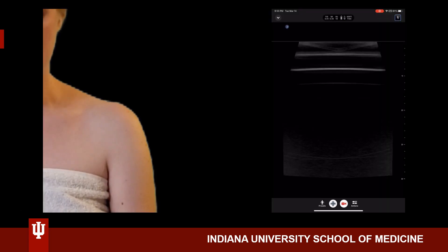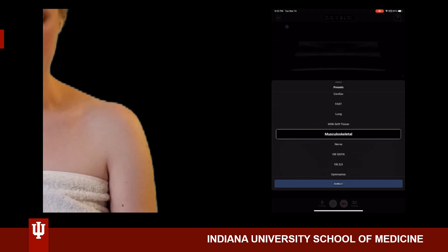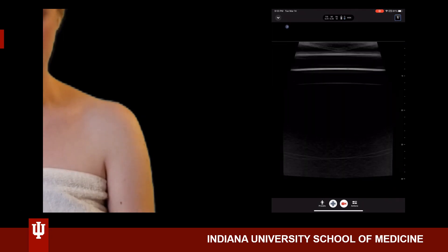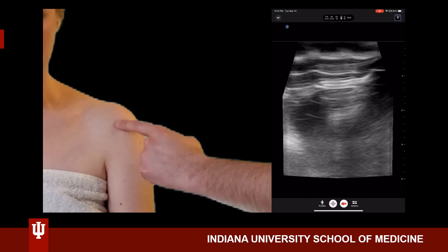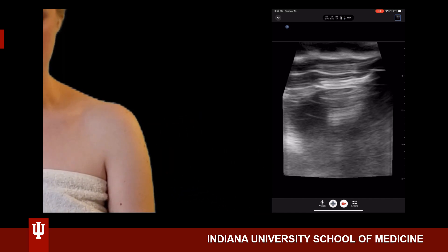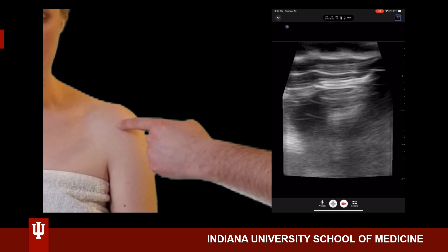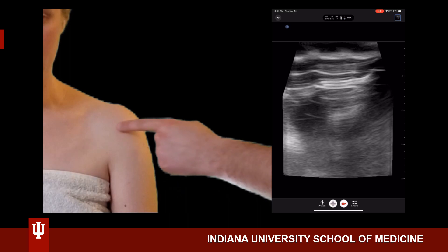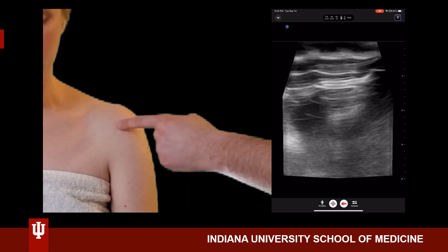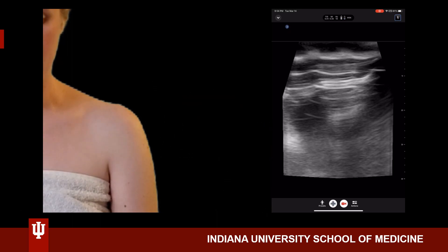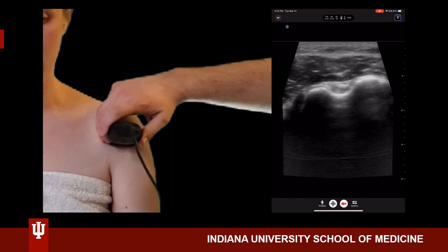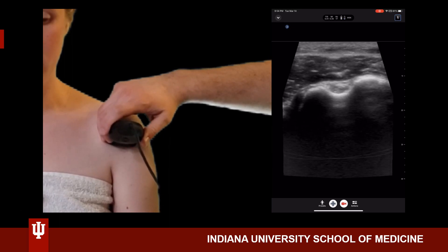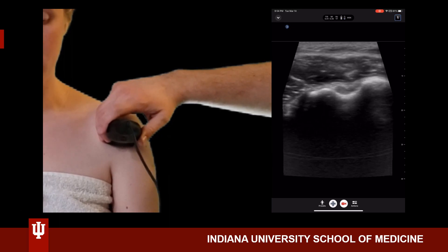When evaluating for a rotator cuff tear, choose the musculoskeletal or soft tissue preset. Keep your marker dot towards the patient's right or their head. Home base is the biceps tendon or the bicipital groove. The subscapularis will be medial to that; the infraspinatus and teres minor will be lateral; and the supraspinatus will be superior to the bicipital groove, which is a U-shape on the humerus with the biceps resting comfortably inside. The subscapularis tendon will be medial to this.